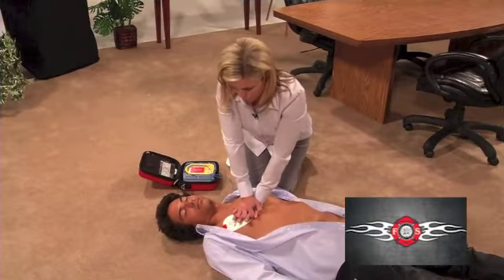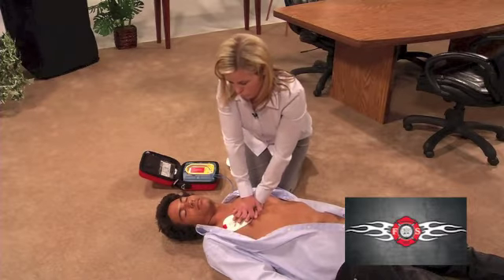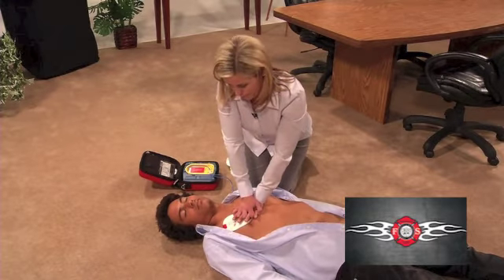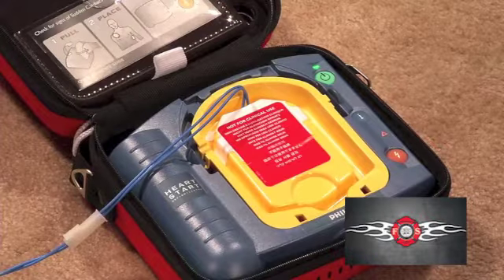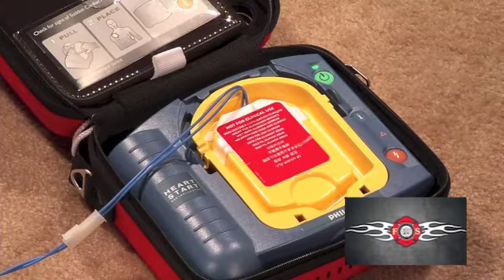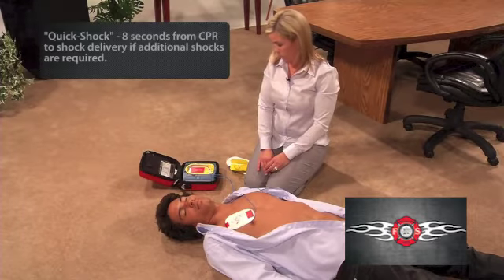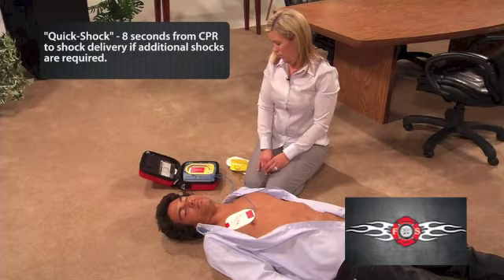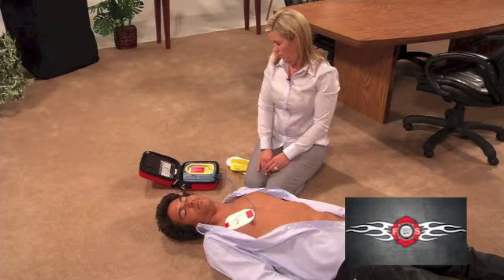While you perform CPR, the AED will interrupt you at regular intervals so it can check if another shock is necessary. Stop CPR. No one should touch the patient. Analyzing. Keep standing clear of the patient while the AED is evaluating the patient. It may decide to shock again, or it may say, Shock not advised. It is safe to touch the patient.